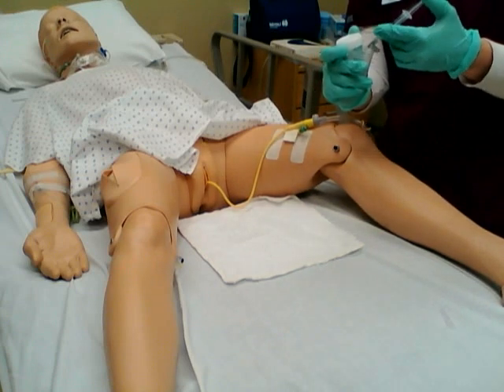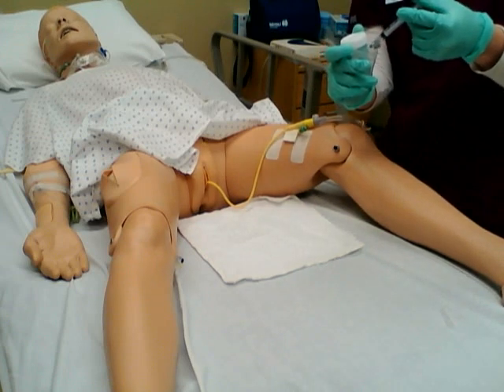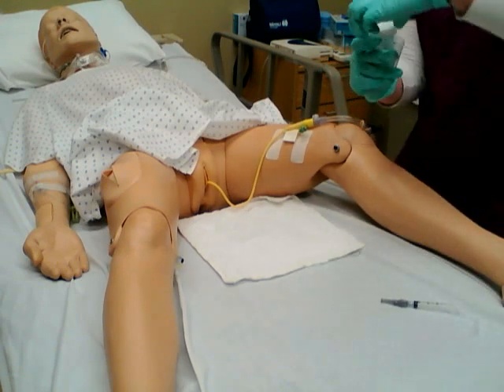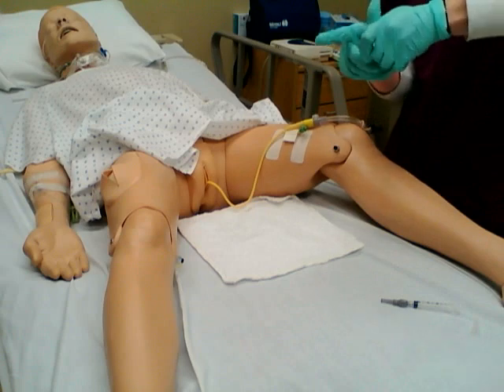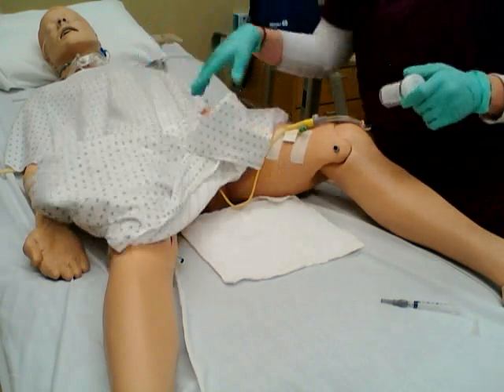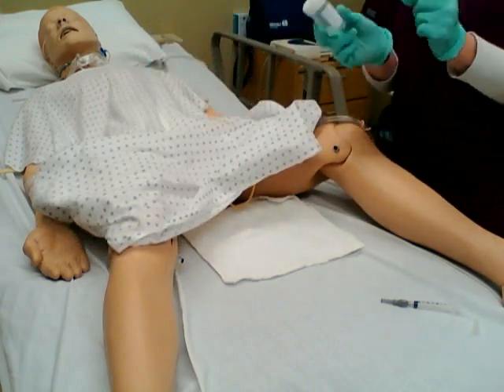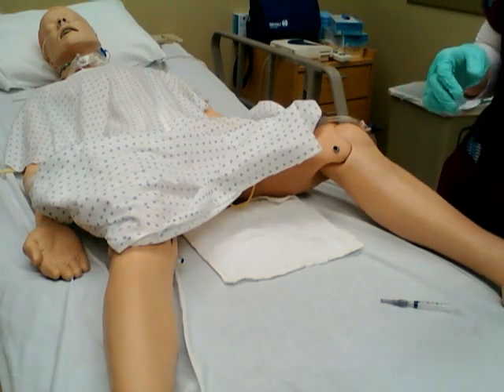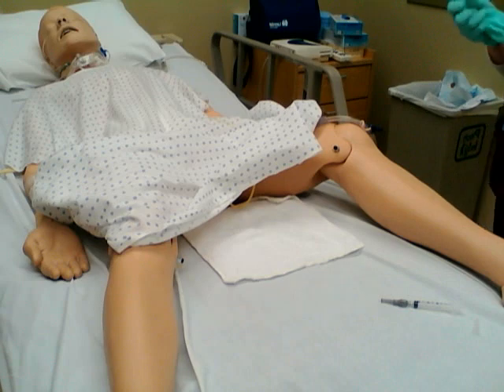Put my specimen in my lab container. Insert. Cap my specimen bottle. I would sign, date, and label it, and there was also a label included in our catheter bags.